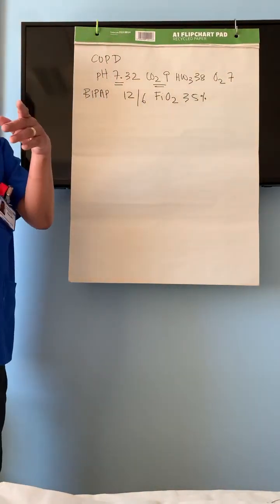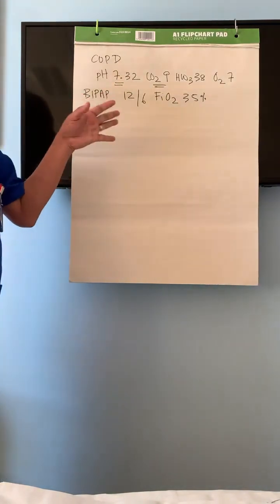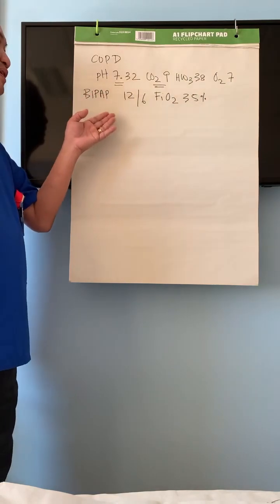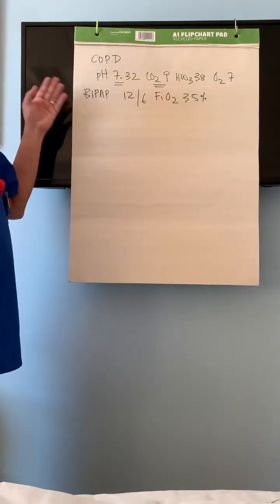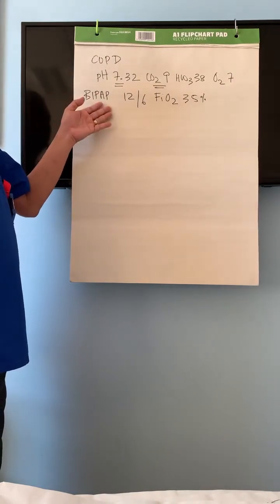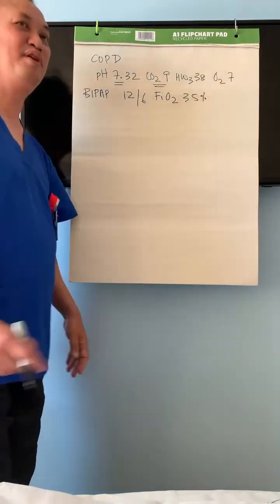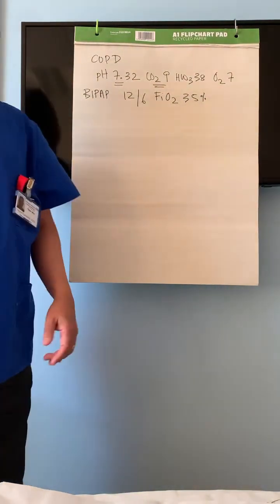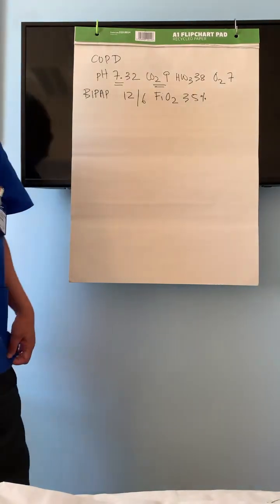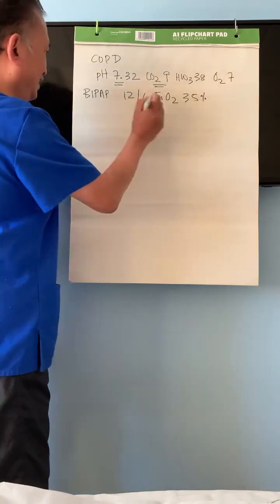So whenever, as a doctor, you request our nursing colleagues to start the BiPAP, this is the typical figure you need to write. Could you please start the BiPAP? IPAP 12, EPAP 6, FiO2 35%, repeat ABG 1 hour later by yourself, or they will do it if they have the outline. Alright. Okay. 1 hour later.